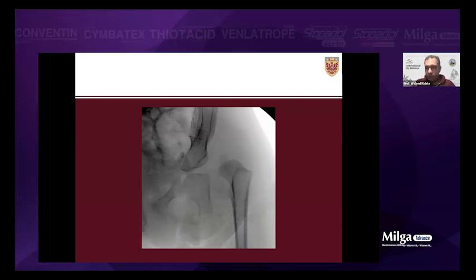So at this stage, you'll clean some of the capsule. You'll see the capsule. Your guide will be the femoral head because it's dislocated. It will be under your dissection, and it will be your guide, and you start to peel off the rectus.